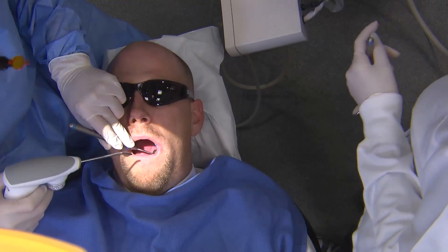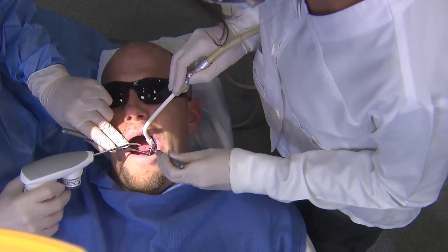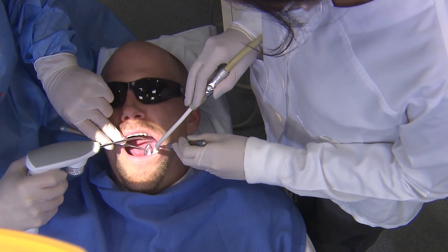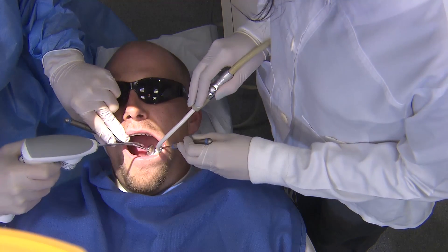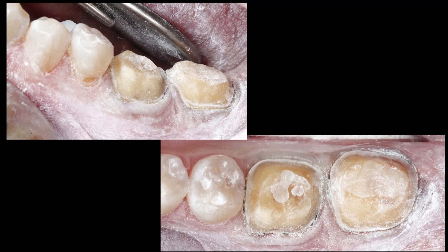We are going to utilize the 3M True Definition Intraoral Scanner. I will apply a very light mist of the contrast agent — just a little bit. You don't want to completely cover the areas you want to scan; you still want those areas exposed. All this will do is help the 3D-in-motion technology that the 3M True Def uses to capture these areas.